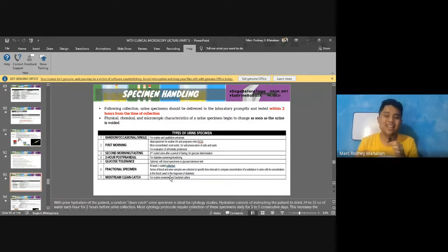Because again, concentrated kayo ang solutes. So, less chances gyud of false negative. Okay? Because even if gamay ra kaayo ang amount sa solute na nasa ihi, because the fact that it's really concentrated, it stayed in the bladder for pila ka hours, then the higher chances of detecting it.